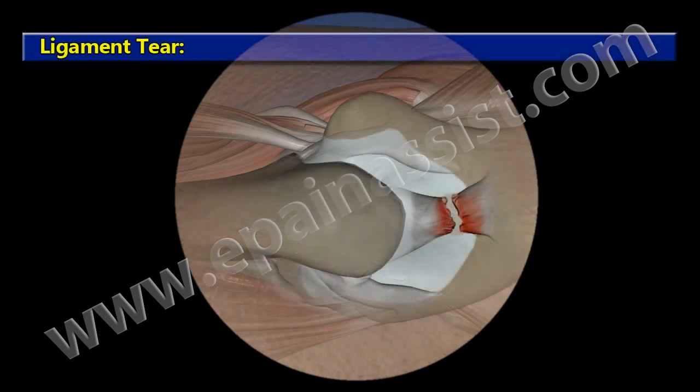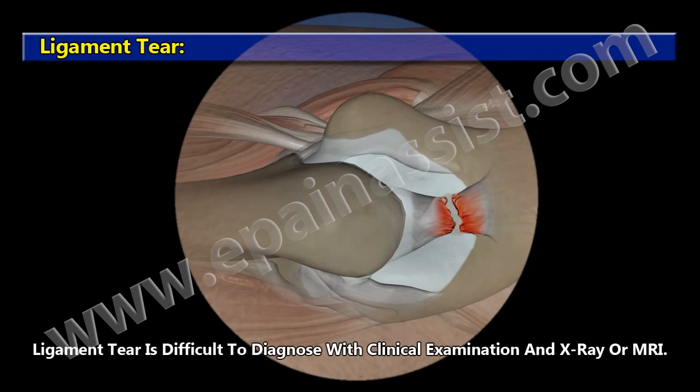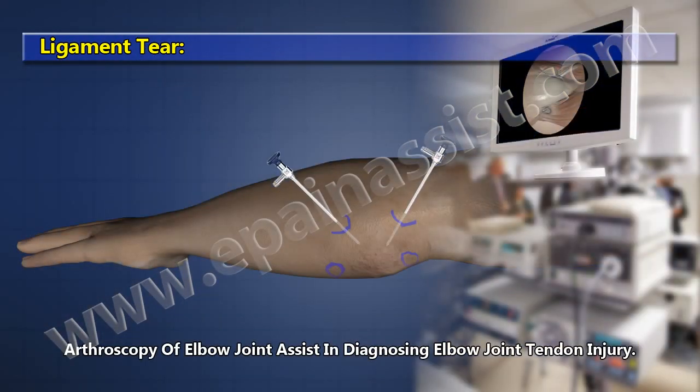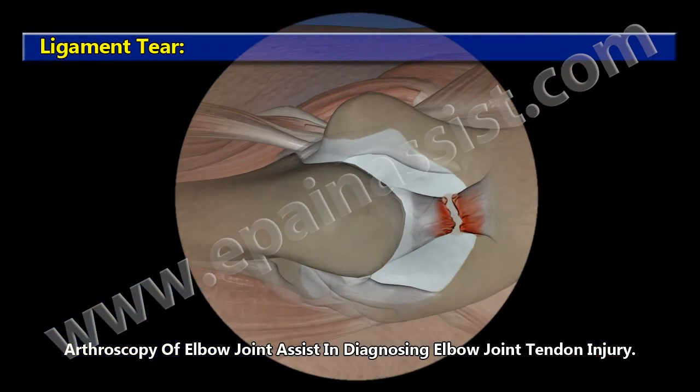Ligament Tear. Ligament tears are difficult to diagnose with clinical examination, X-ray, or MRI. Arthroscopy of the elbow joint assists in diagnosing elbow joint ligament and tendon injuries.